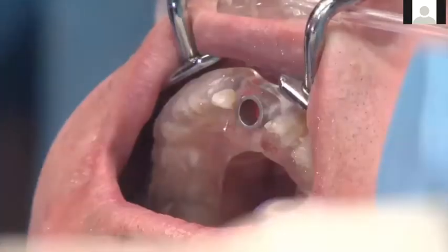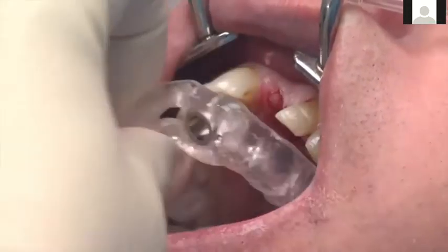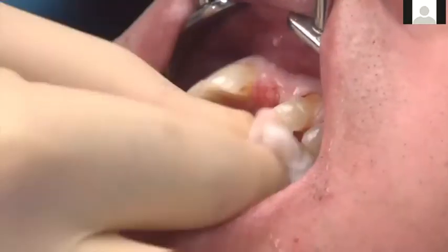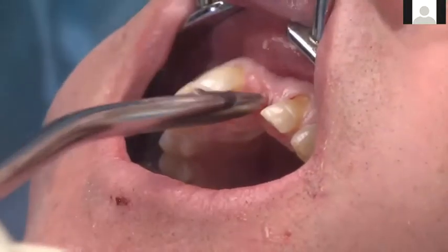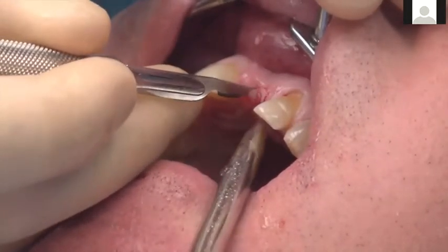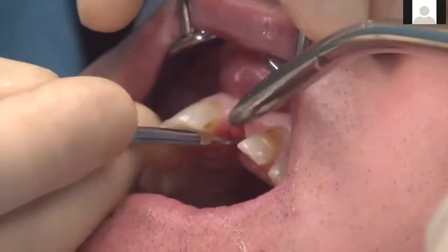Once you do that, many people have contacted me and said that after they do this punch, they get a lot of tissue tags when they remove it. So what you have to do then is, before you try to remove that punch, go ahead with a sharp blade. Usually I use a 15C and just trace the outline of that punch very carefully, especially when you're doing it here in the anterior area.